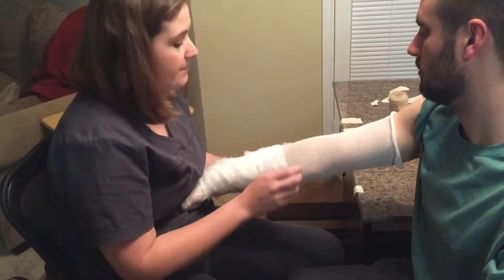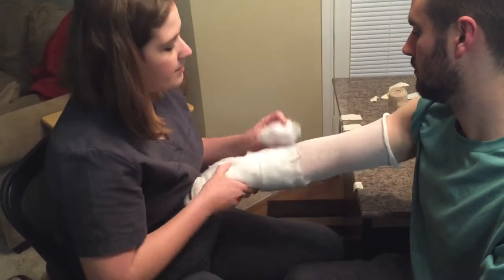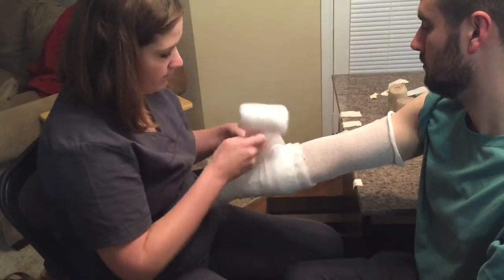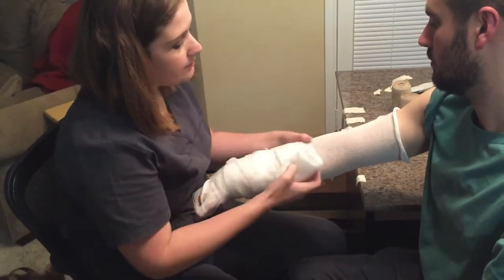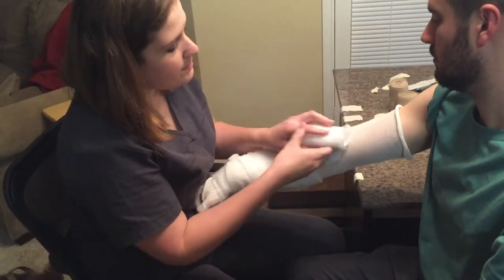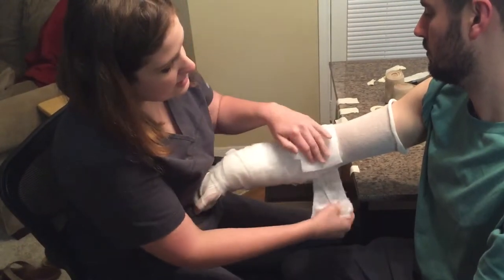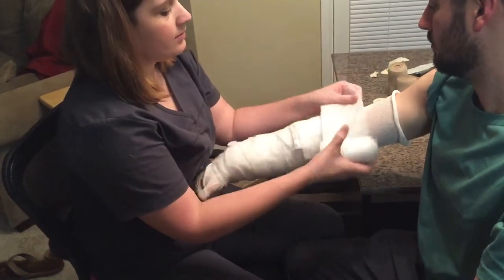Does that make sense? All right. When we get to the bend of your elbow, can you bend your elbow? I'm going to finish this off right here and then we'll move to that part because it's going to be a little different. It doesn't really matter how pretty it is — it just matters that you get it on there. When we get to your elbow at that little crease right there, you want to make sure that you have extra padding right here because that little dip can be problematic if it's not properly padded. The lymph doesn't keep flowing and it just collects right there — we want it to be all evenly compressed.